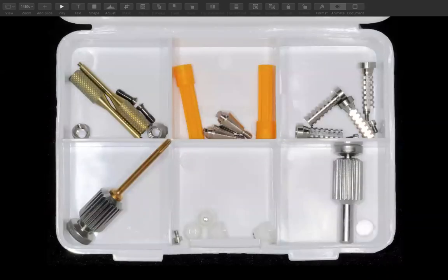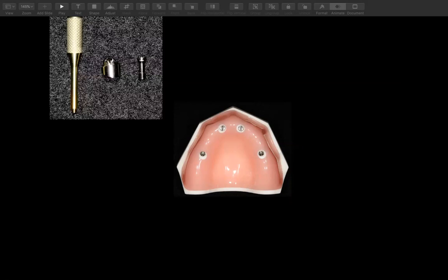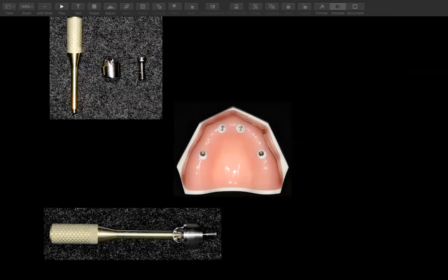Now, one good practice is you could contact your Nobel rep and see if you can get some sort of kit that lets you handle the parts and pieces so you can familiarize yourself with how that works. They can even give you a model. I don't know if there's a cost for them to let you use that, or for the model. But you can make a denture off of it, and then you can do your own conversion at the laboratory before you go out.